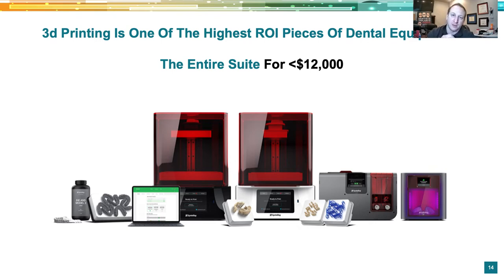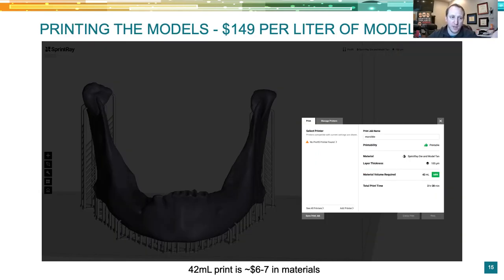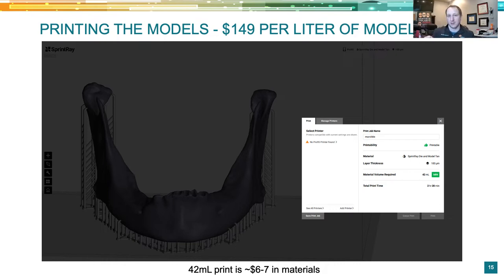For printing one of these anatomical models, it takes about two and a half hours with model resin at 100-micron layer thickness. It's about a 42 mL print — roughly $6 or $7 in material at about $150 per liter. Surgical guides are usually only about 4 mL because they're really small. So this is more resin, but still under $10 in materials. Print it overnight or during lunch — it's not expensive at all.